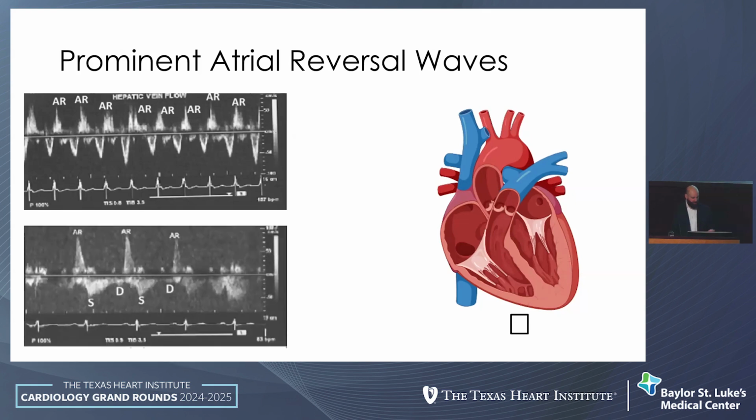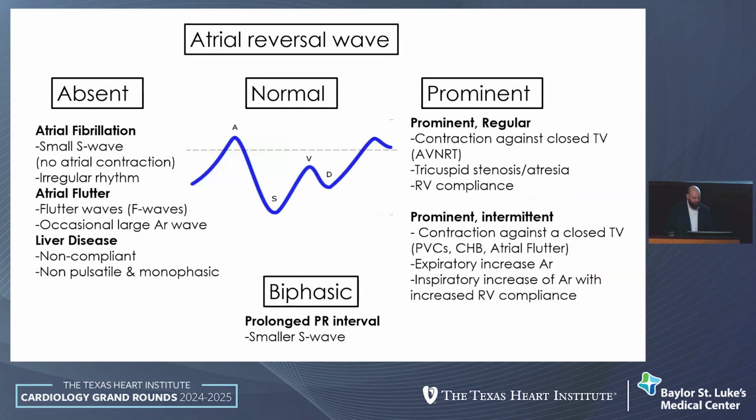Likewise, a patient who has this very rare clinical entity of tricuspid stenosis, look at those giant A waves. Has nothing to do with systolic flow reversal, it's just a stenotic tricuspid valve. And again, you may be scoring higher on the VEXUS scoring system because you don't have a good understanding of the physiology. So basically, you start to actually create an understanding of the differential diagnosis according to what you see in the atrial reversal wave.